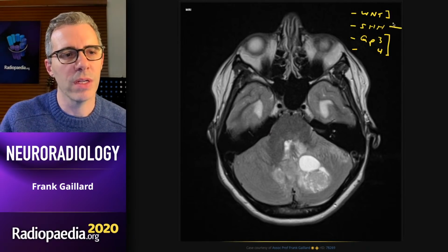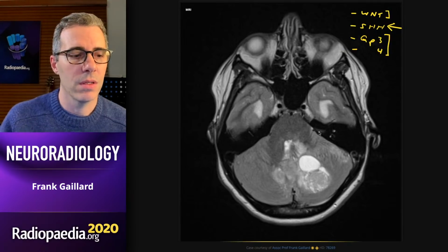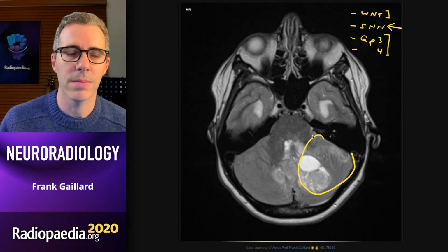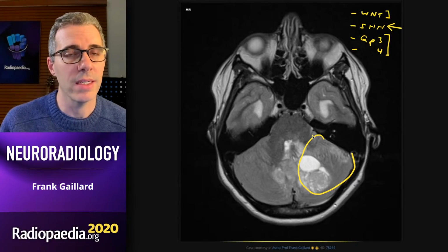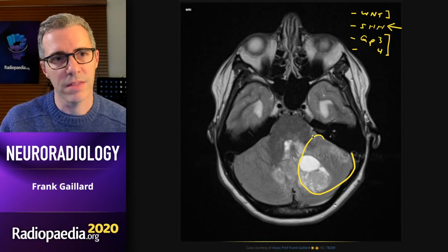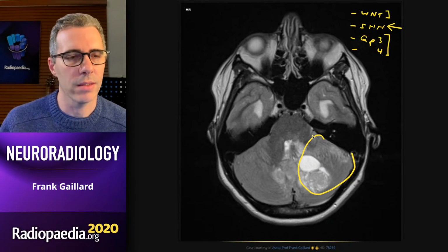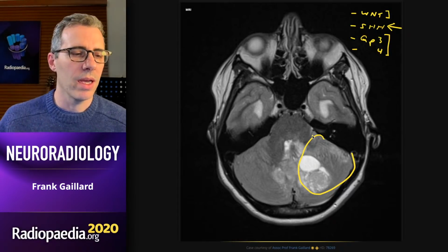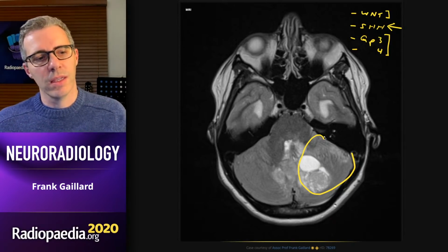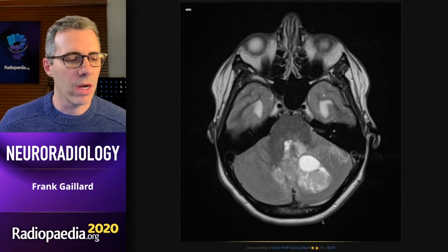Sonic hedgehog falls a little bit in between, and it can be seen in kids, can be seen in the midline, but in young adults, it's seen in the lateral part of the cerebellar hemisphere. It is typically heterogeneous in appearance, with cystic areas, solid areas, but it will still have low ADC values because it can't help but be a small round blue cell tumour. In addition to the molecular classification, you will also get a histological classification, like classic and anaplastic and desmoplastic and nodular. And the nodular desmoplastic type is almost always sonic hedgehog and is almost always in the lateral hemisphere. So in this case, you can actually predict the molecular subtype with a fair degree of certainty based on the MRI.